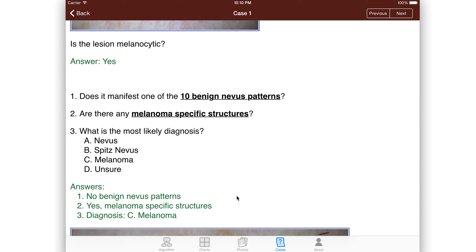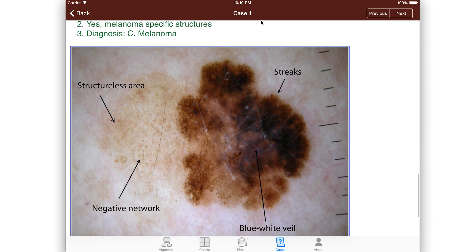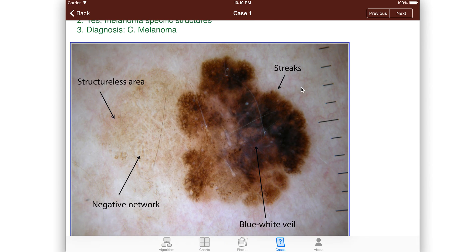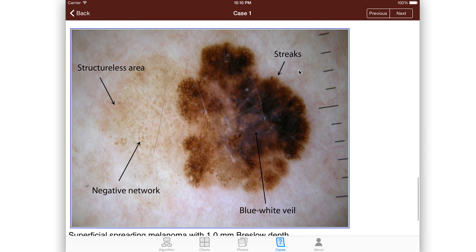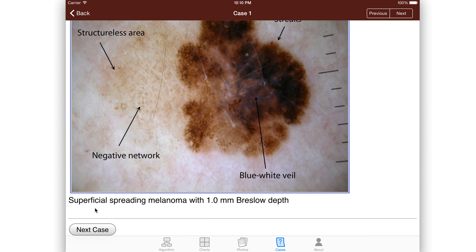The most fun part is that once you have your answer, you now actually get the structures pointed out to you. Here's that negative network. Here's that structureless area. Here's the blue-white veil. And here are the streaks. We tell you what the particular melanoma was and what its Breslow depth is. And you go on to the next case.